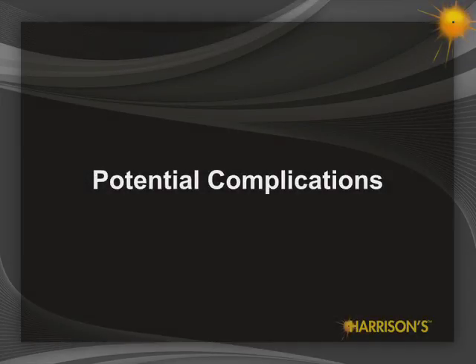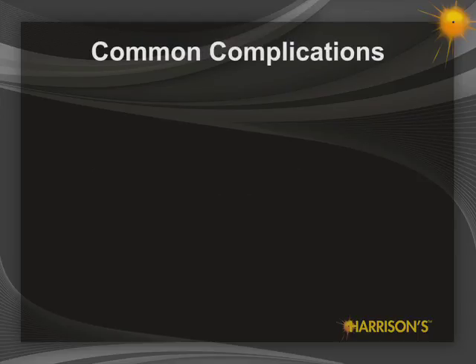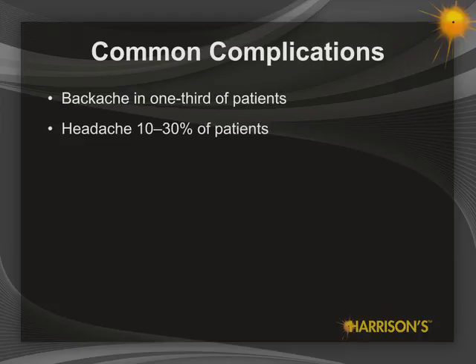Lumbar puncture is a relatively safe procedure. In a small percentage of patients, complications may occur. The most common complications are backache, seen in up to 1/3 of patients, and headache in 10 to 30% of patients. A post-LP headache is attributed to low CSF pressure due to a persistent dural leak, causing traction on pain-sensitive structures.